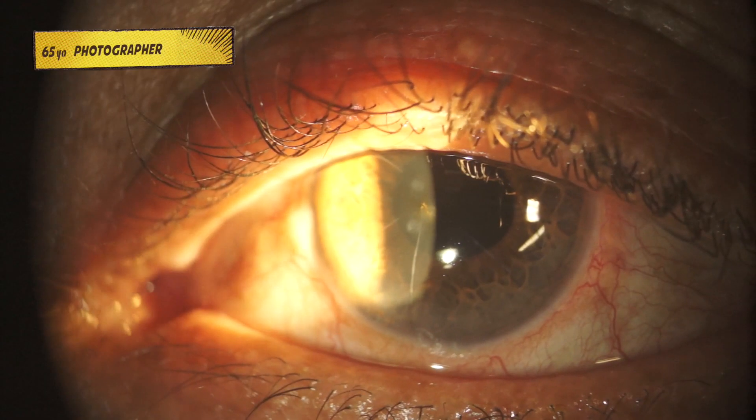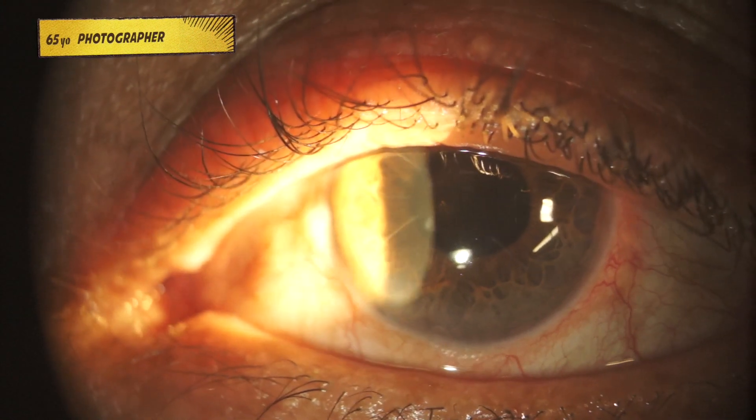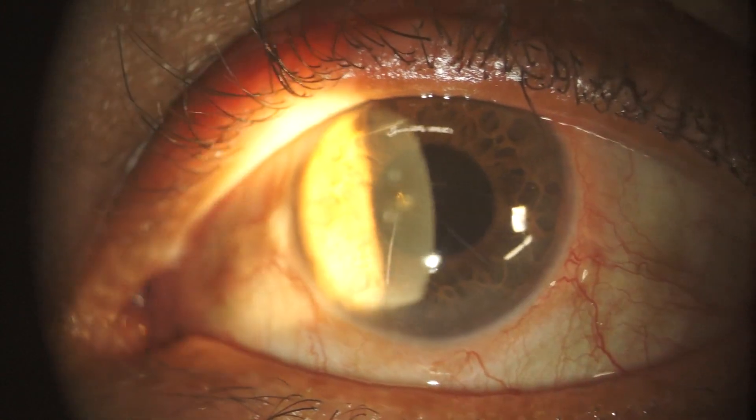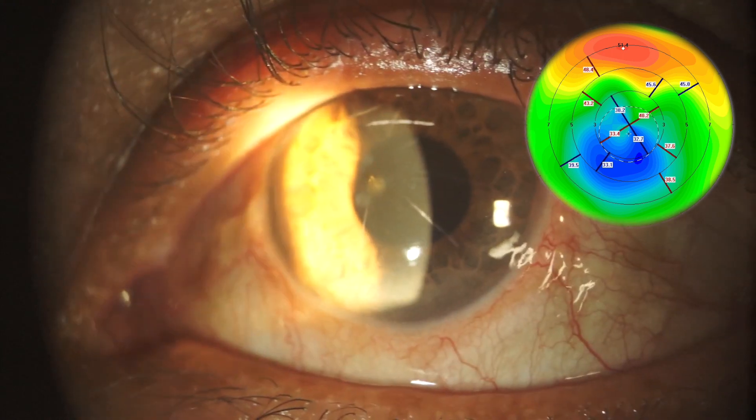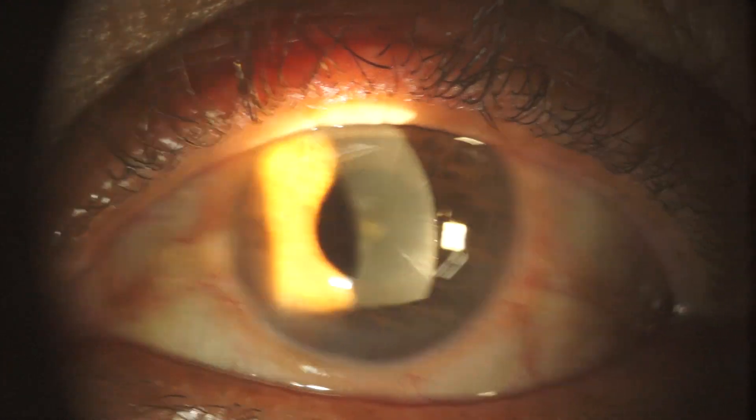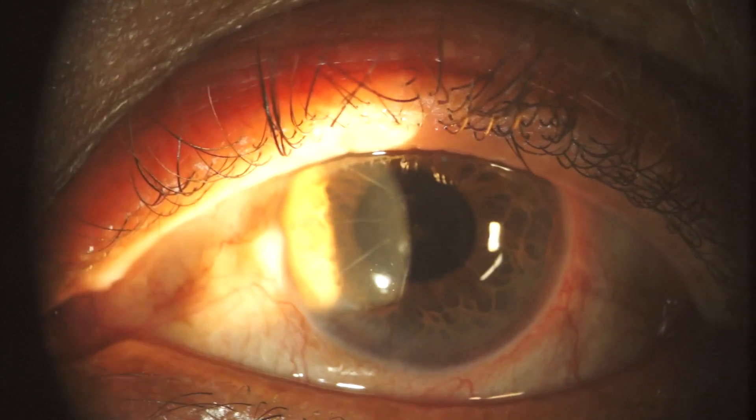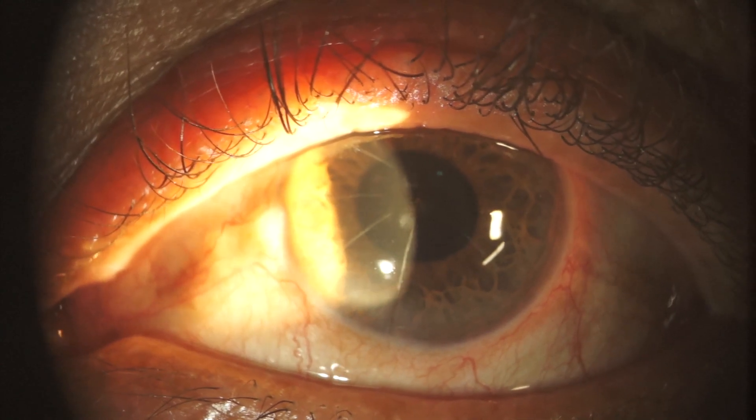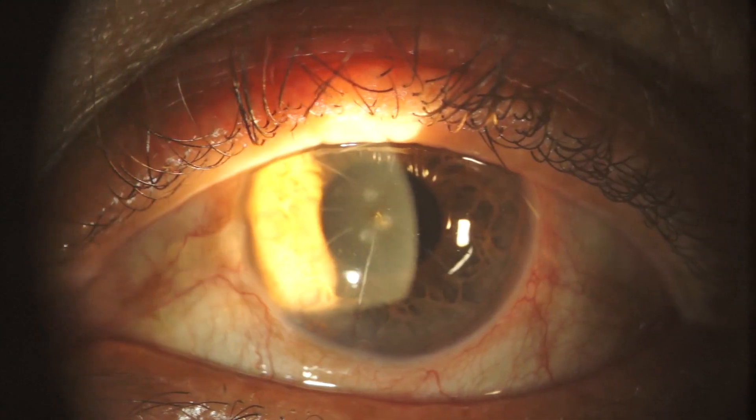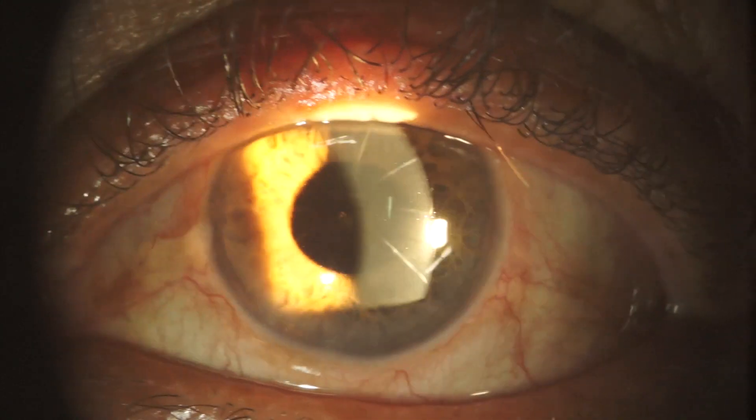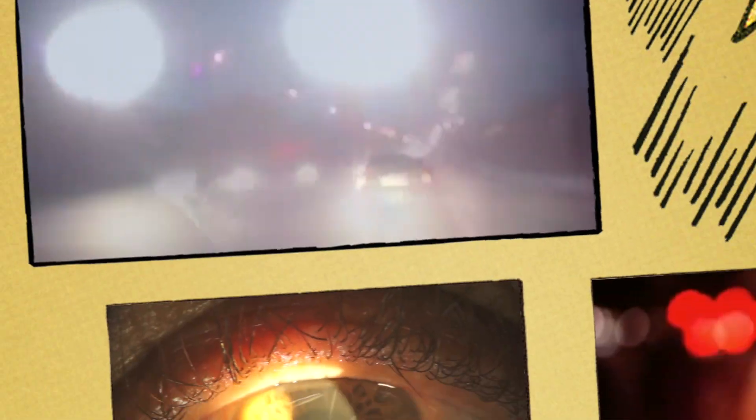This 65-year-old patient underwent radial keratotomy in the past and was left with severe corneal irregularity. Note the size of the pupil in relation to the RK optical zone. Not surprisingly, after bilateral cataract surgery, he complained of glare and severe starburst and was very disappointed with his cataract surgeon. What can we offer to those patients?